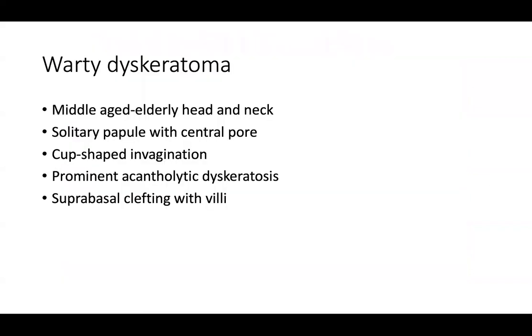Warty dyskeratomas, these are fun diagnoses to make because they occur in middle-aged to elderly patients on the head and neck. They can be a solitary papule with a central pore, a cup-shaped invagination. And clinically, there may be some concern, obviously, for squamous cell carcinoma. So you have to have a high degree of suspicion on these.